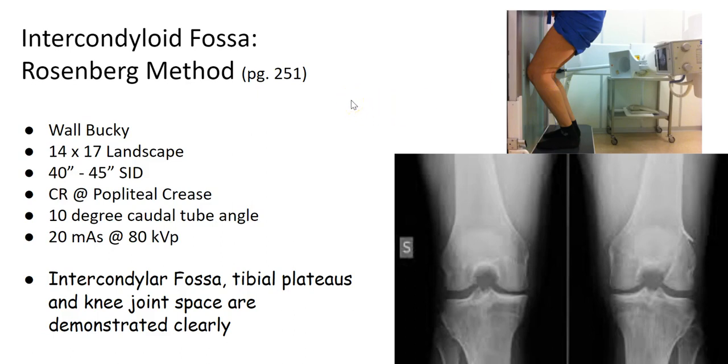How do we know we're correctly positioned? Well, you want to be able to visualize the tibial plateaus and the knee joint, the joint space, open very nicely.